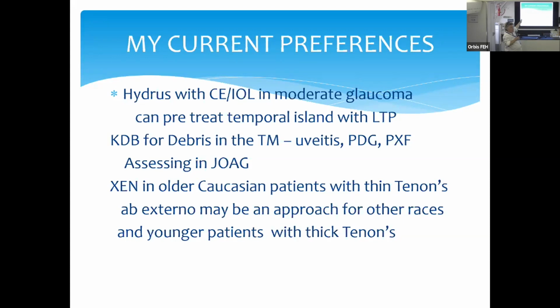So you know what? He has a cataract. So we go to the OR, we do the cataract, we put in the Hydrus. You know, his pressure's 14 now, and he only takes Timolol, right? So I got him on a dirt cheap drug. I tell him to do it once a day in the morning, and I got his pressure cut down a number of points. And I've done that with several patients. I've been doing the controlled eyes and putting in a Hydrus, and that helps me get their medicines down. And that guy had already had lasers, so that had been exhausted on him, right?